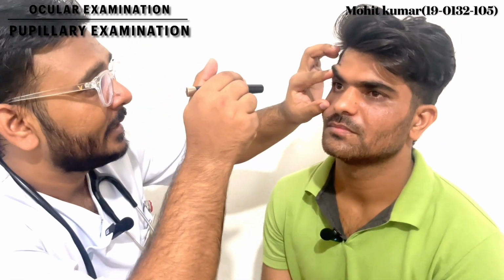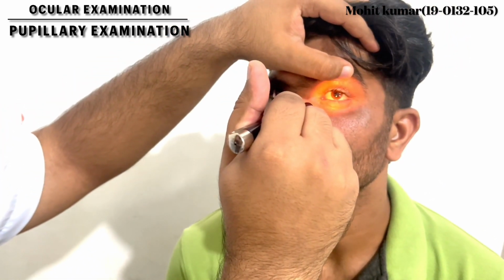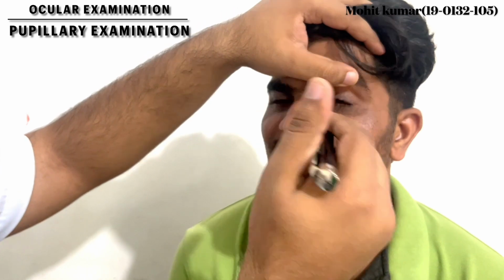Now we're going to do the pupillary examination. We will see the pupillary reflex to light. We're going to put the light inside our patient's eye and we will see the direct pupillary constriction. Okay, now this one is for the direct, and the pupil is going to contract. Now we will check for the consensual.